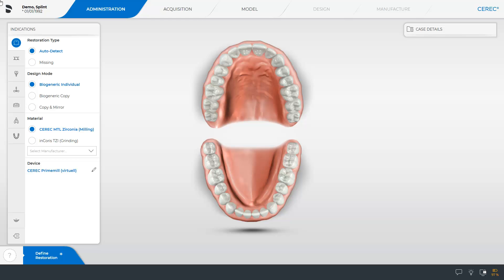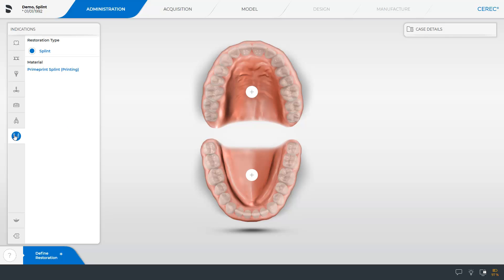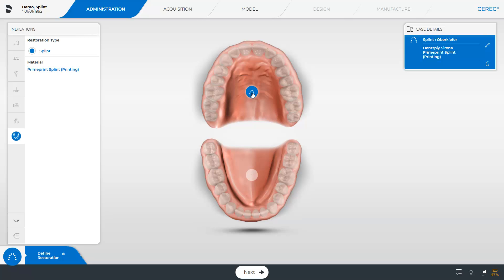We are in the administration phase, and we will first select the indication: splint. Next, we tap the appropriate jaw. At the bottom of the screen, the little arrow to the right with NEXT is displayed. Since our focus is on the workflow, you will see the image catalogs that have already been scanned.